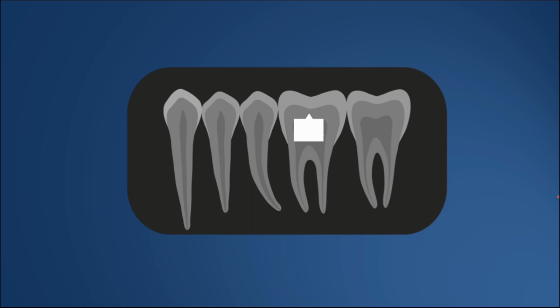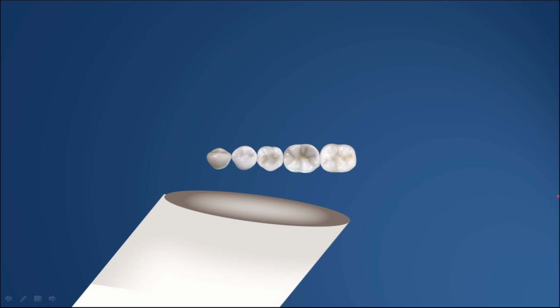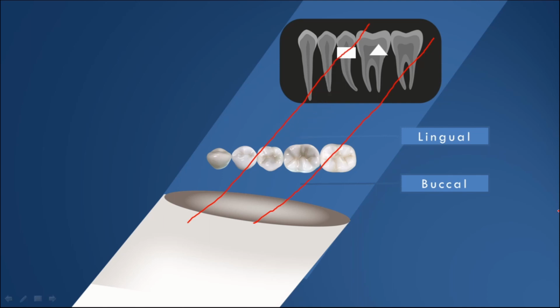We have to follow a small clinical tip so that in all radiographs we can differentiate buccal from lingual. So before taking the radiograph, just tilt the X-ray tube around 20 degrees mesially. Now make the radiograph. Now instead of the X-ray beam traveling straight, it will travel in an angulation. Now both the buccal and lingual objects will be recorded in different places in the radiograph. They never get overlapped. The object on the buccal side will be recorded in the radiograph distally, and the object on the lingual surface will get recorded mesially.